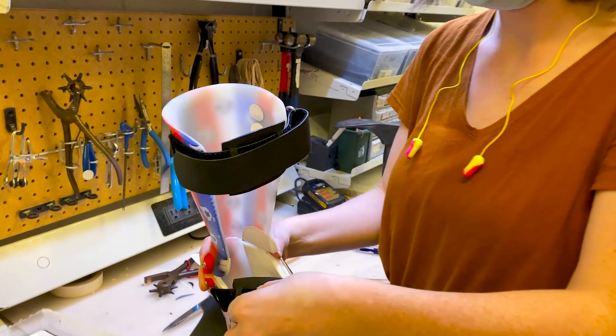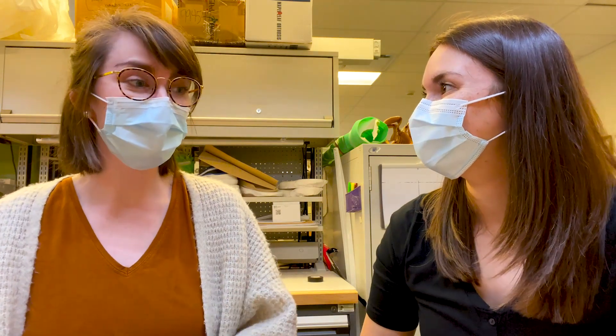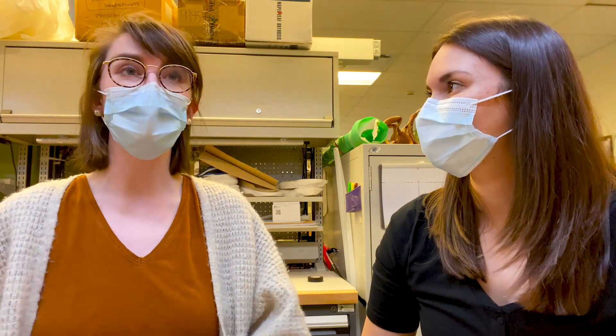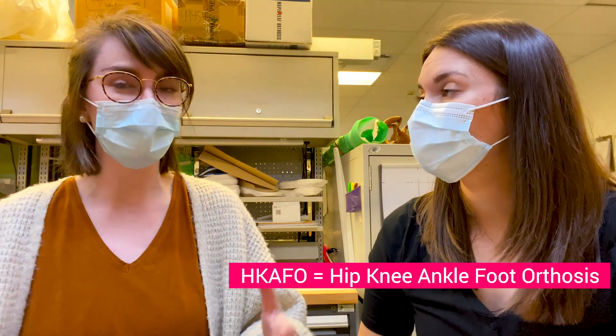And there you've got it — the finished product, ready for a fitting with the patient. Now that you've seen what an AFO is like by itself, we're moving on to something a bit bigger: it's called an HKAFO, or a hip-knee-ankle-foot orthosis.